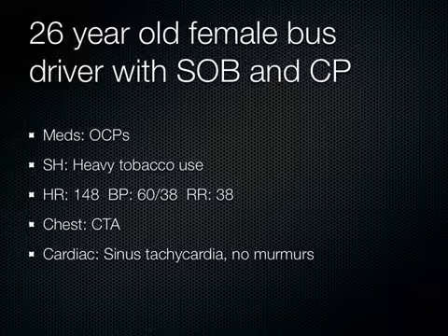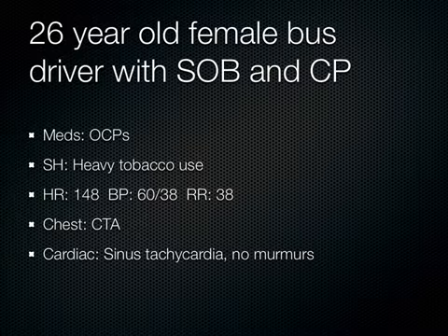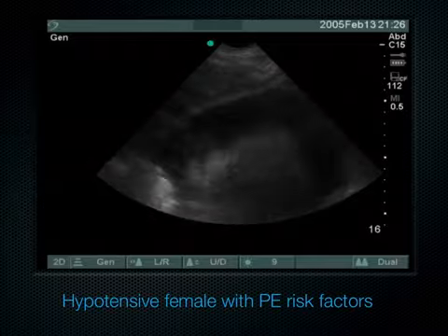So I actually had the nurse get the thrombolytics out for this patient, and the father's asking me, well, are you sure it's this blood clot in the lung? I said, well, yeah, clinically I really think that's what's going on. How do you diagnose it? A CAT scan. But we can't put her in a CAT scan. He was like, well, is there anything else you can do? And then I was like, oh yeah, I can do an ultrasound. And so I brought the ultrasound machine over, and I did this.